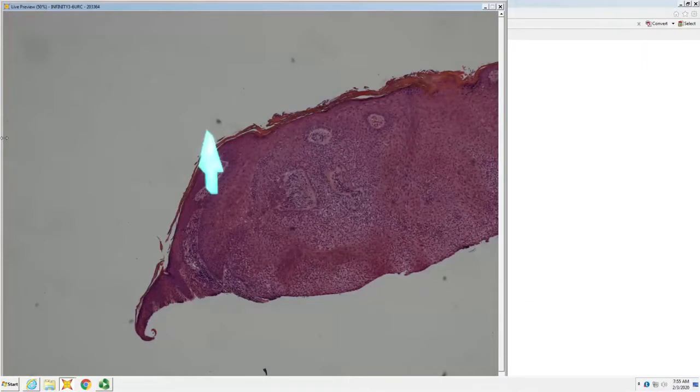Trichilemmoma, very good. So you have something hanging off the epidermis. It has clear cells, it's glycogenated, it has peripheral palisading, and just beyond the peripheral palisade tends to be a nice thick basement membrane zone. So someone pass the easy button over there. You gotta watch them, because they're tricky, those little tricky mamas. Italian, very good.